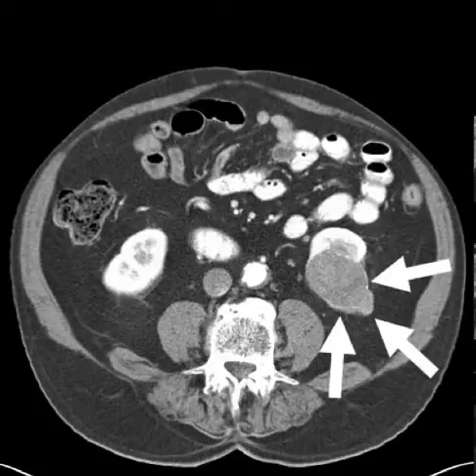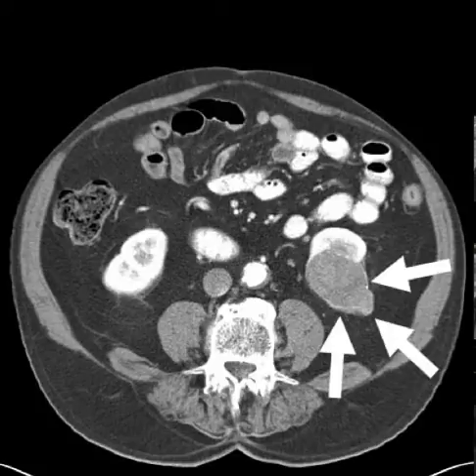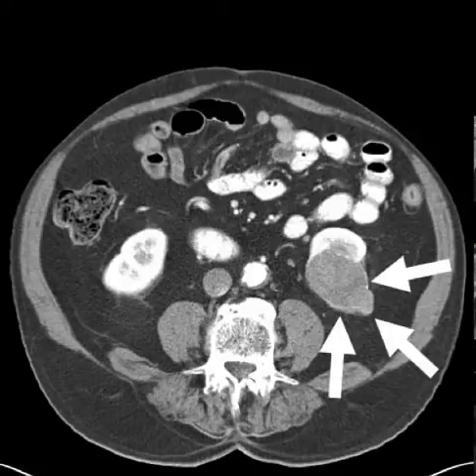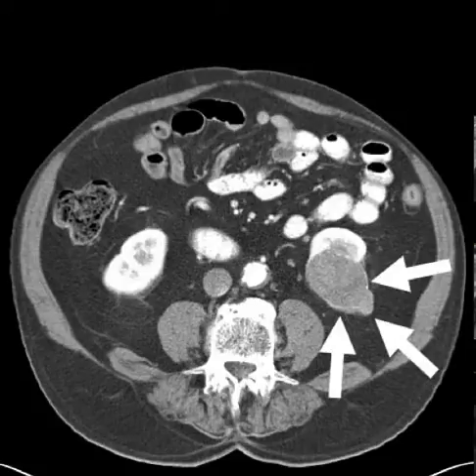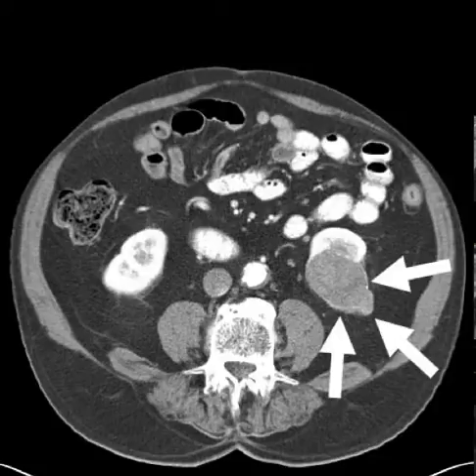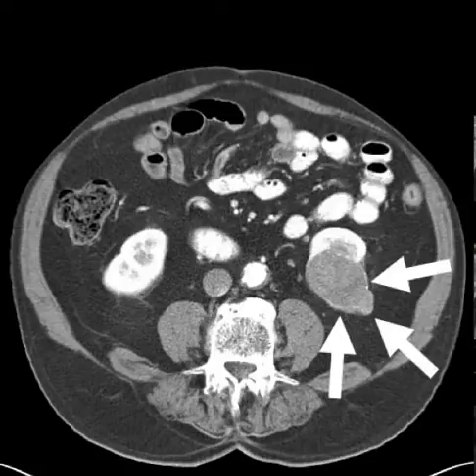That being said, another part of this would be measuring the washout or the de-enhancement. Also, some people say that if we go from an arterial phase to a delayed phase and get a de-enhancement of 15 Hounsfield units, we can more or less make the same conclusion. However, there's a caveat about this, because your baseline enhancement might not be at its peak. So the real washout or de-enhancement that you're getting is not a real value. So you might be underestimating the washout based on this measurement. So I really don't advocate using this technique.